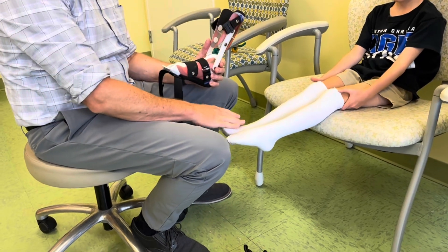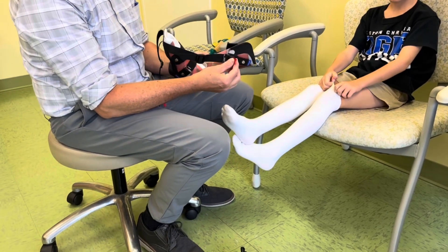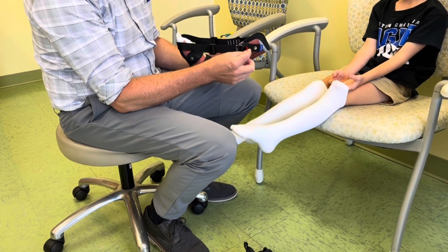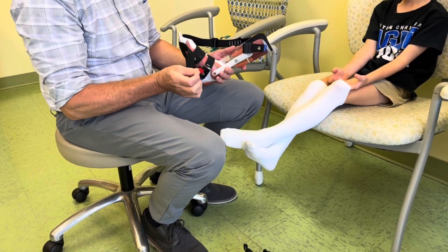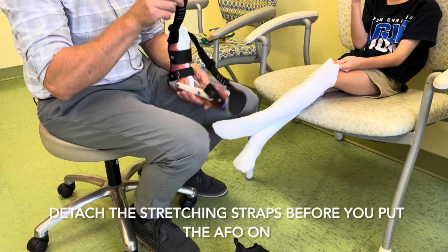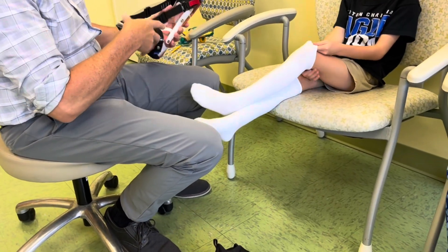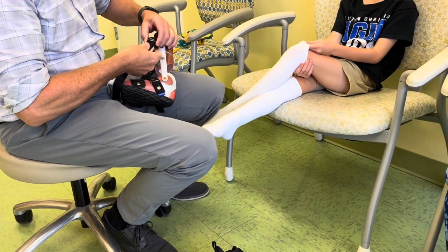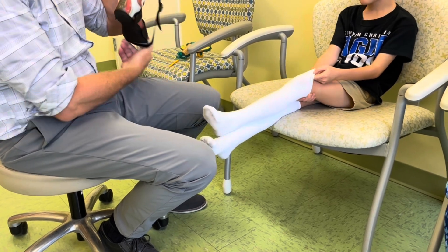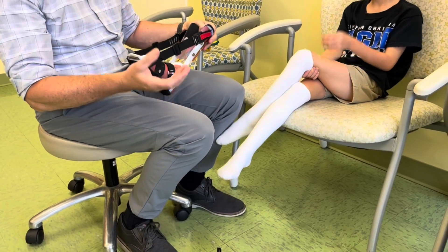Just to show you how this goes on: these black buckles that attach the stretching straps are magnetic, so when you pull the red tab it quickly disconnects, and to put it back together it snaps right into place. I did put hash marks on the straps here for you to use as a reference. We want to start with the first mark — right there on the edge of that little piece — so you know where we're starting on both straps. The goal is to get the patient comfortable and tolerating wearing it.